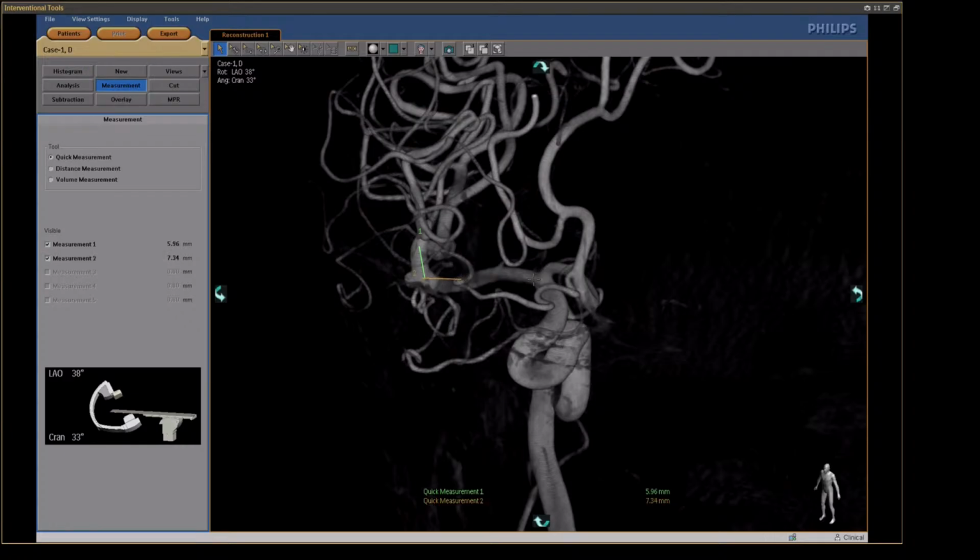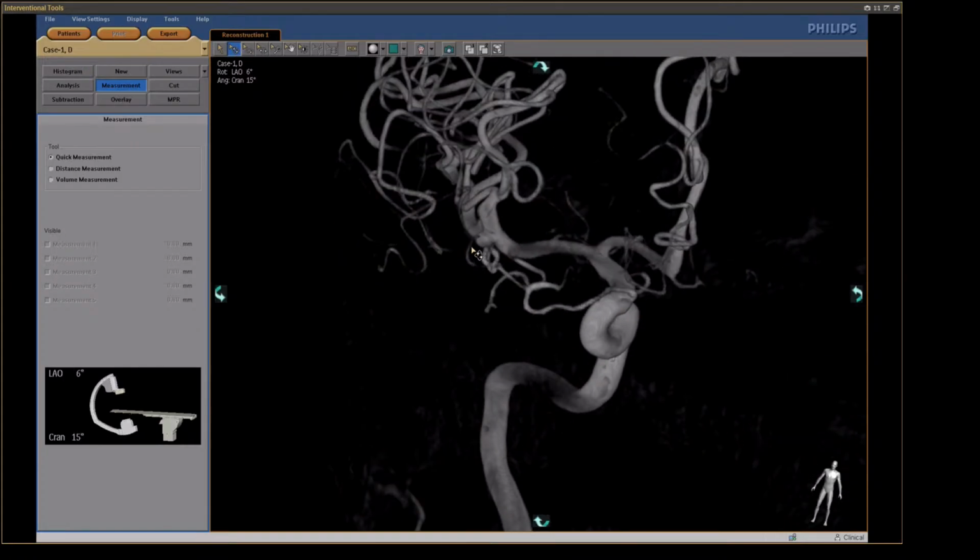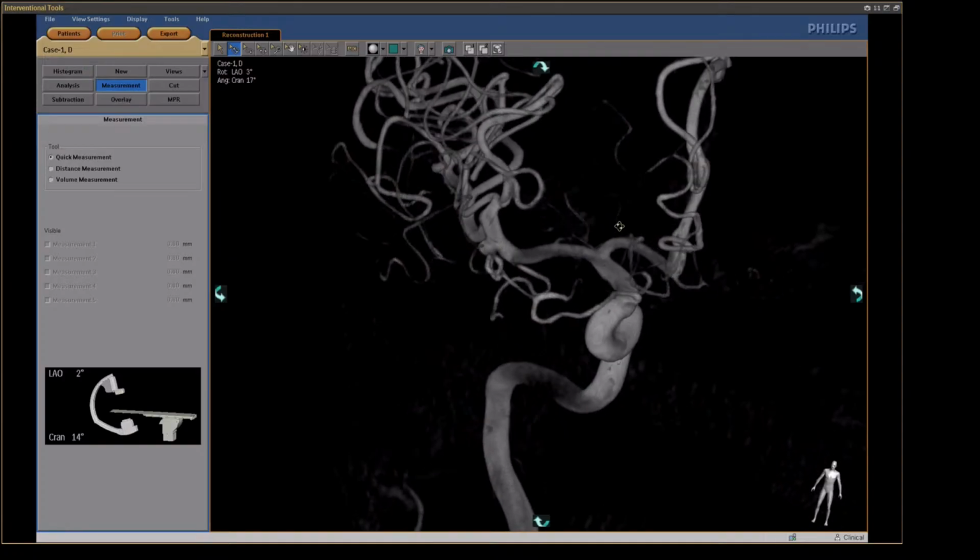The artery diameter is nearly 2.86. We have a 2 millimeter Leo Baby. It's possible to do stent monotherapy, but this was ruptured.